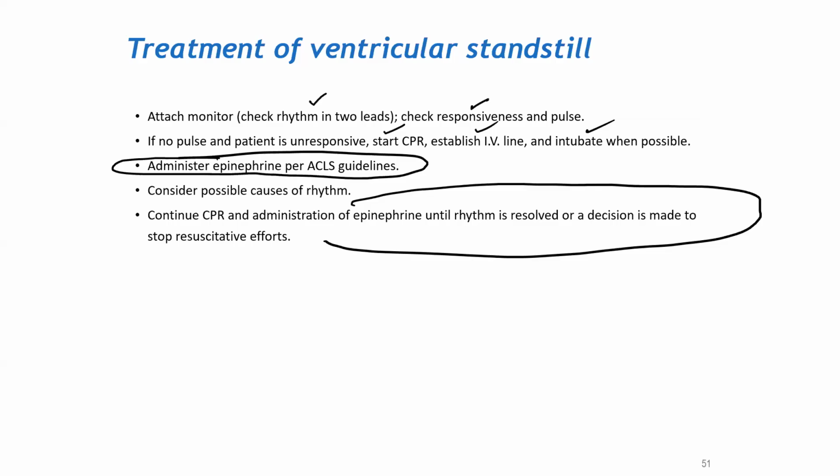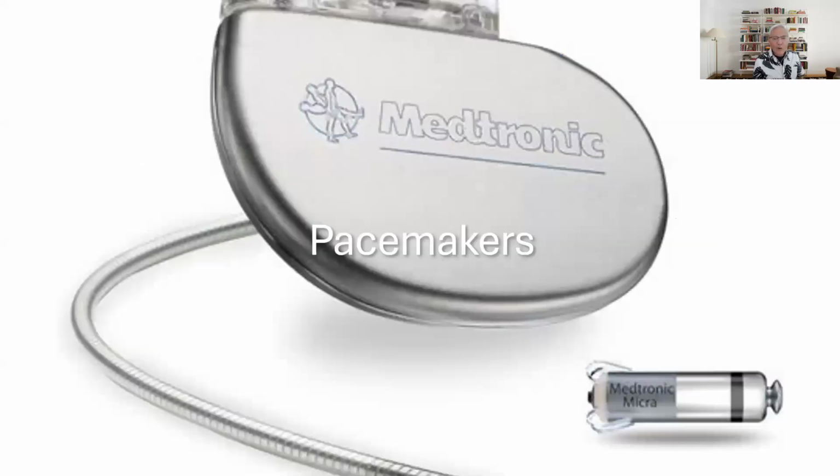Okay. All right. The next thing that we're going to talk about are pacemakers. So pacemakers are electrical powered units similar to this. It's very small, and I have a pacemaker right here. Actually, this in my hand is a pacemaker. It's very, very small. This one was from a patient that had the whole thing replaced, so I took it in order to use it for teaching. But anyway, it's very, very small, and it's implanted subcutaneously.